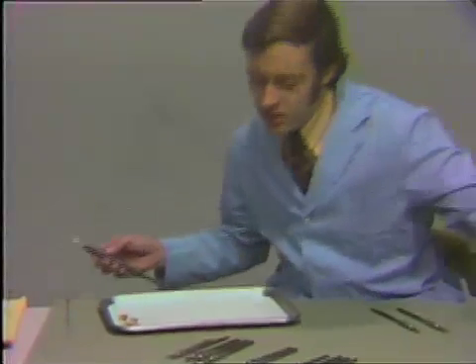This is adjusted just about right — perhaps a little bit more power and just a little bit less water. You want it to hit in a fine slurry as it hits the tip of the instrument. When using this in the mouth, collecting the amount of water that accumulates can be a problem. It's easiest to use this instrument with an assistant. If using it without an assistant, keep it in a fairly upright position so the patient does not have difficulty with water accumulation.